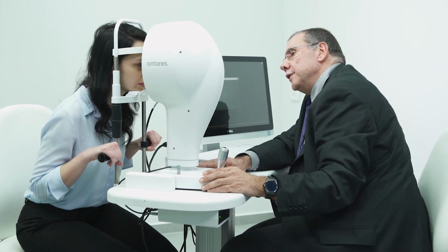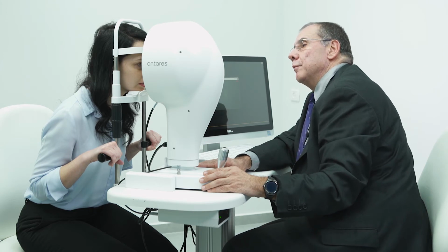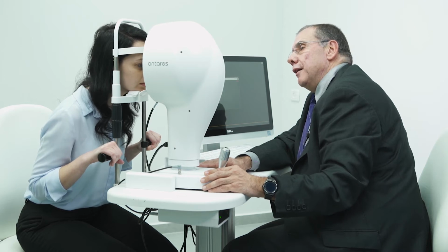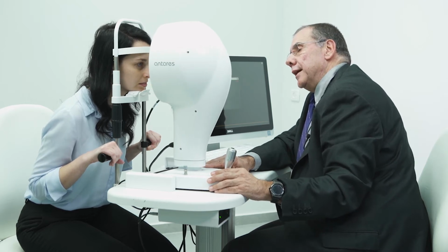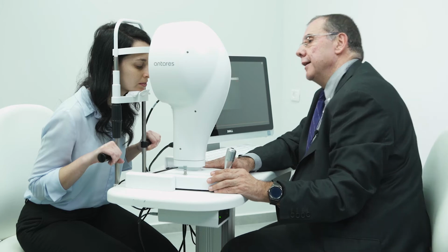What we're going to do is explain to the patient that they're going to be looking straight ahead of them without blinking. The program will start automatically when we ask the patient to blink twice. They have to blink twice, and that is going to start the actual program running automatically.